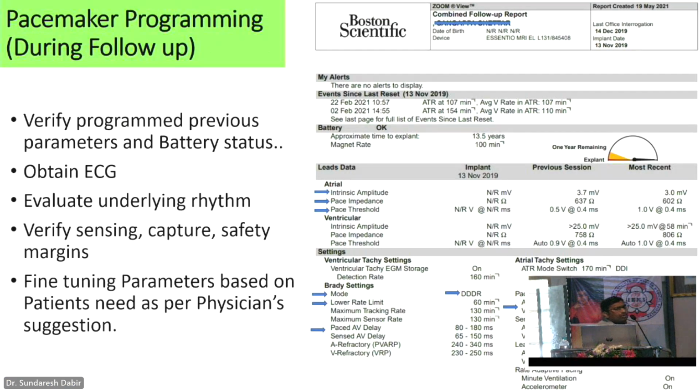Okay. Pacemaker programming during the follow-ups. This is very important. It is during the follow-up, not during the implant. What are the parameters which you need to look at? We need to check thresholds and impedance. We will show you again through the programmer what the nominal parameters required for this are.